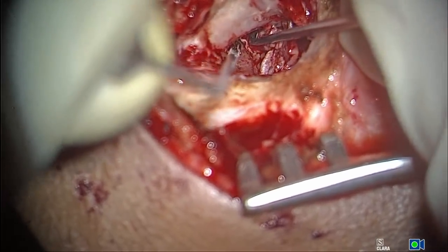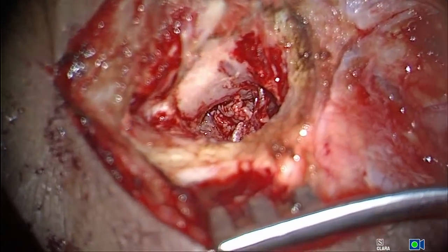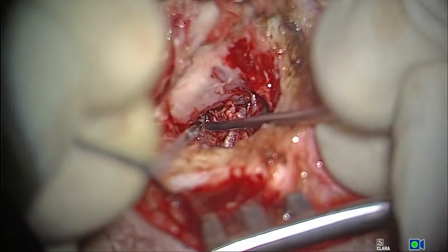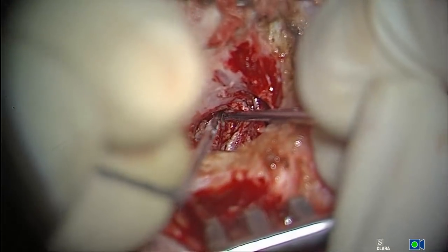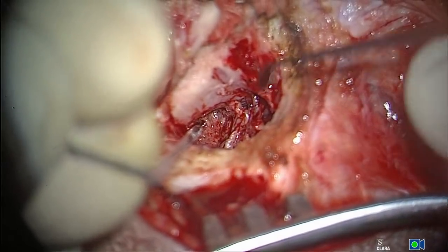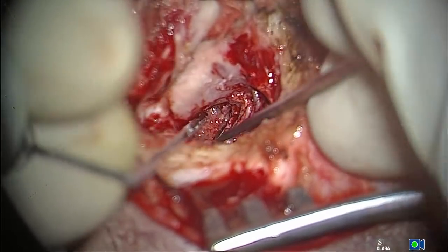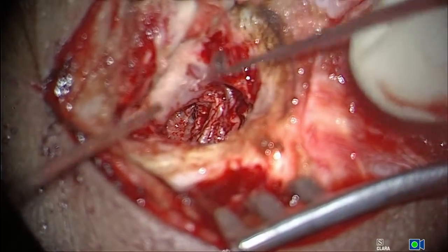It all depends on the middle ear mucosa. If the middle ear mucosa is like this, very, very healthy, then I will not even bother about anything. I will straight away go in and graft this perforation, and we have not faced any problems in our cases. If the mucosa is a little edematous, if it is unhealthy, then you have to think of all these pathways, the ventilation pathway. If the ventilation pathway is blocked, how will the mucosa be very healthy? This is the first point which I want to ask you.